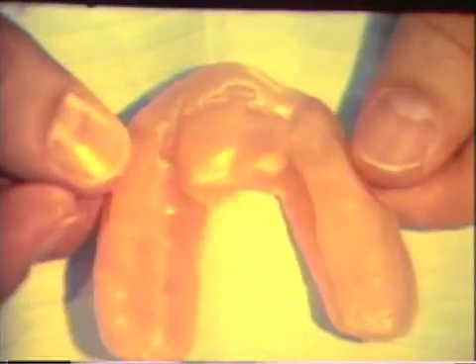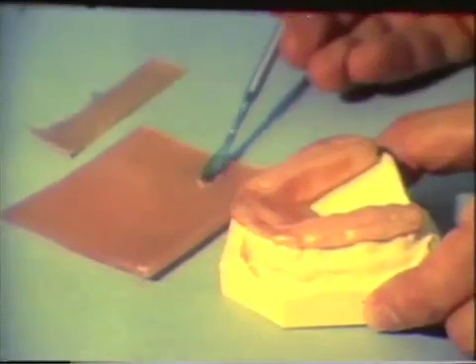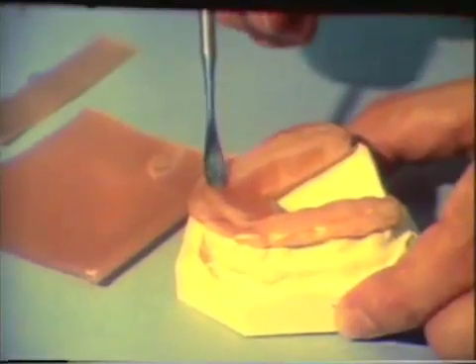A new centric record is made with this wax pattern. The imprints for the anterior teeth will maintain the vertical dimension. The occlusal surface of the wax is inspected. Wax is added palatally to the mandibular tooth contacts. The area of excessive contact of the lower anterior teeth is flattened. A plateau is fashioned extending about two millimeters posteriorly to the imprints of the mandibular incisors.